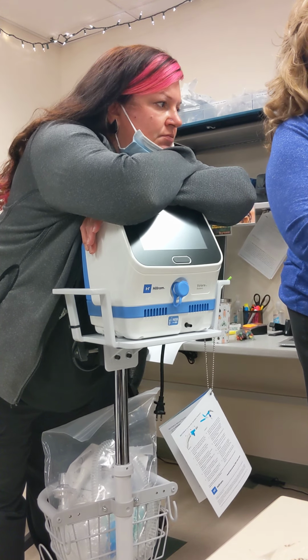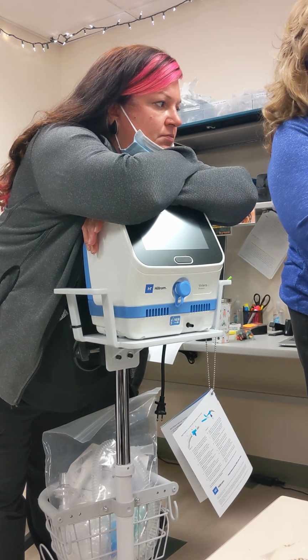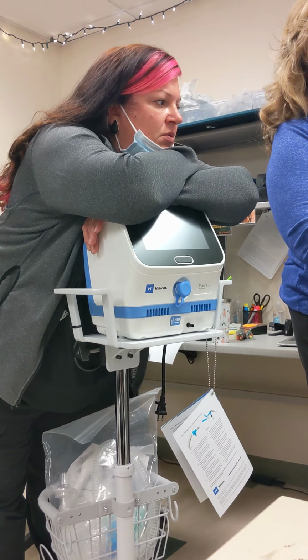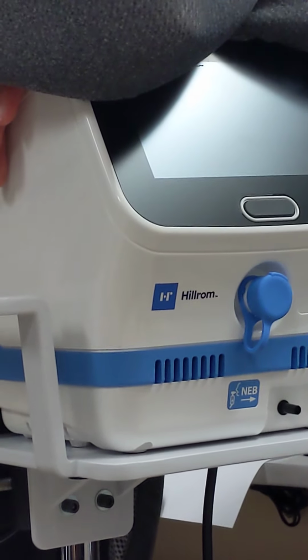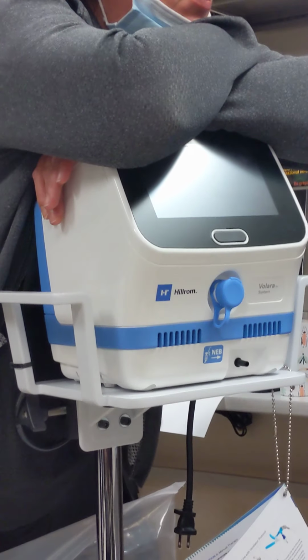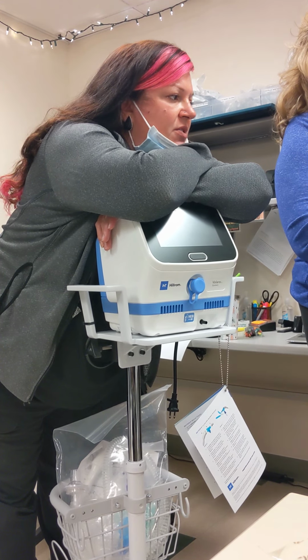If I wanna add more, or change the name, I just hold it down. This was the first time I ever tried to do it, and I was like, oh shit, because he was already critical. We were bronching him daily. You were using oscillation and PEP therapy, going back and forth, changing it in line with the vent. I tried that, and then I wanted to do the other one.